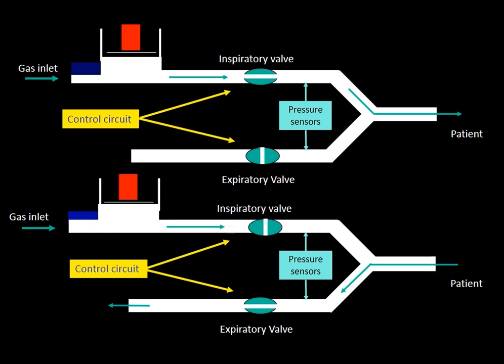Basically, ventilators have different equipment inside, but all ventilators do have an inspiratory branch by which they control the flow being delivered to the patient through an inspiratory valve, and during exhalation there is an expiratory valve that allows the exhalation of the gases. So, as we will see also in pressure control, when we seem to be controlling pressure, what the ventilator is in fact doing is just controlling flow.